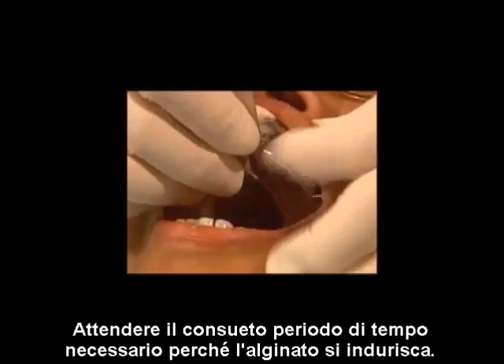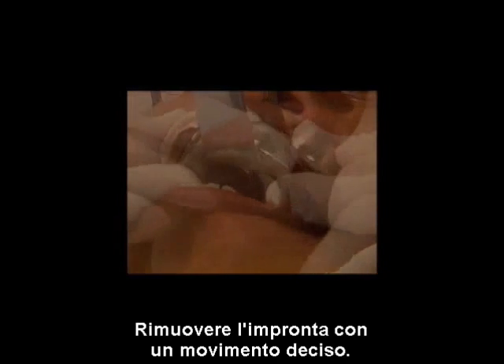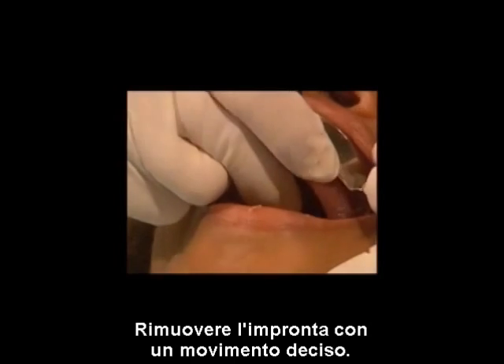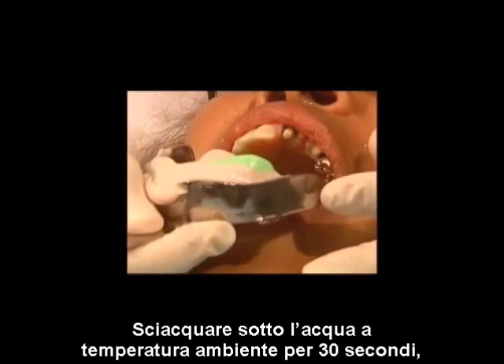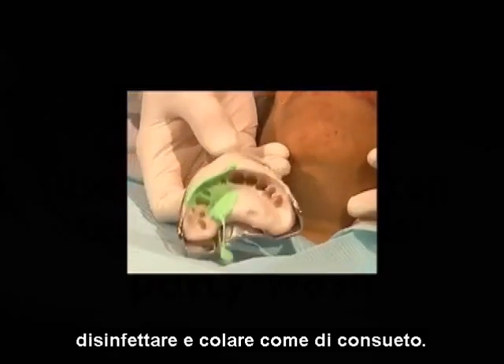Wait the usual length of time for the alginate to set. Remove the impression with a definite snap, rinse under room-temperature tap water for 30 seconds, disinfect, and pour as usual.